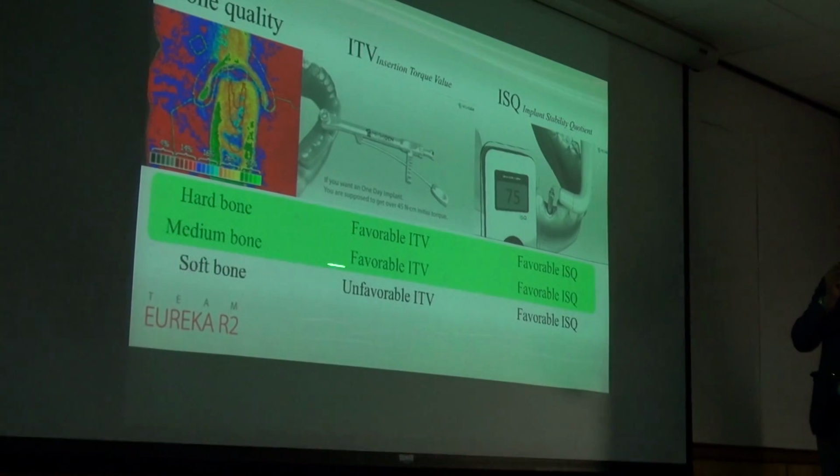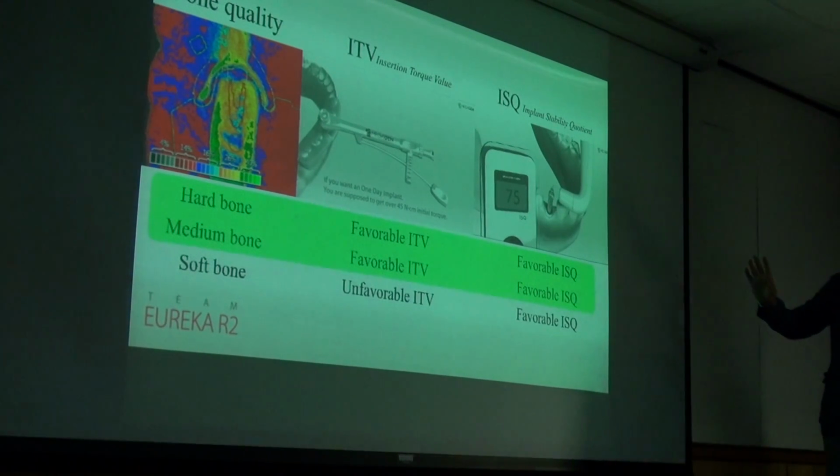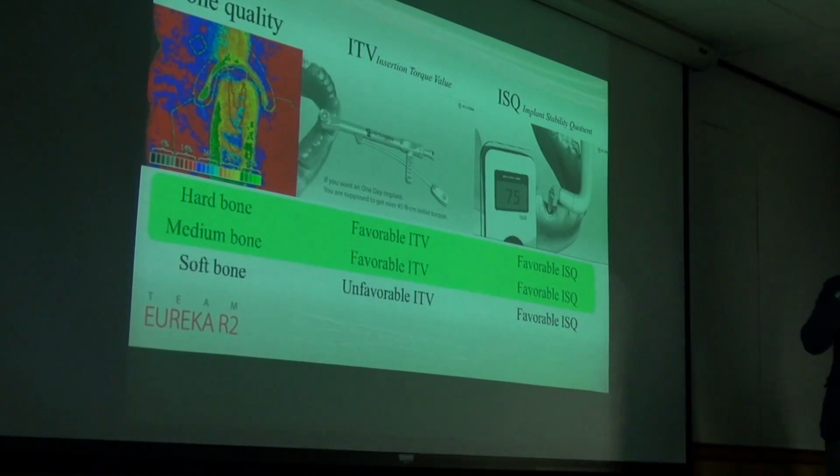So normally I follow these protocols, especially around 70. I believe in the two factors. It's very hard to say in English. Sorry for my English, but anyway, you can understand me. The clinical meaning, the clinical usage of the ISQ value, is the time.